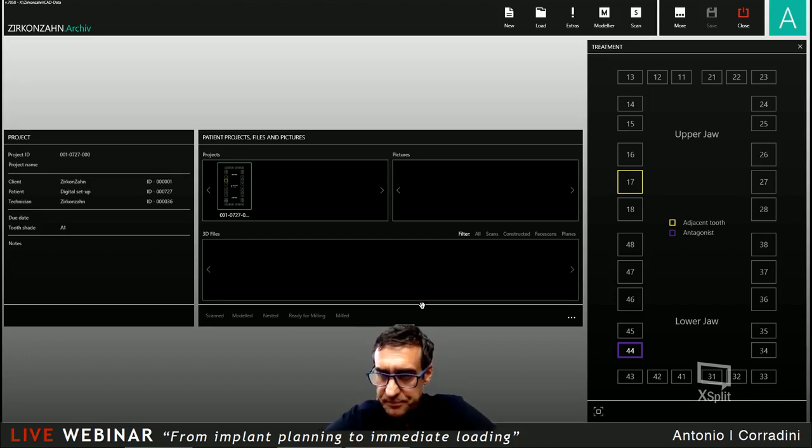But anyway, everything is start from a setup, so we have to create our setup just to have an idea about our setup, our patient, how it looks, our patient with a new setup. And of course, I will show you also, in this case, we use the face hunter and the face scanner.